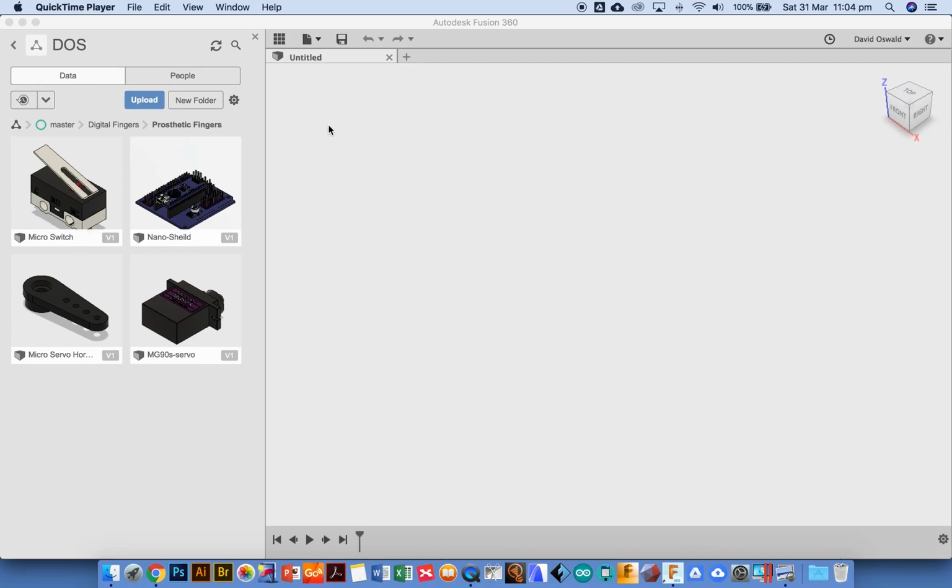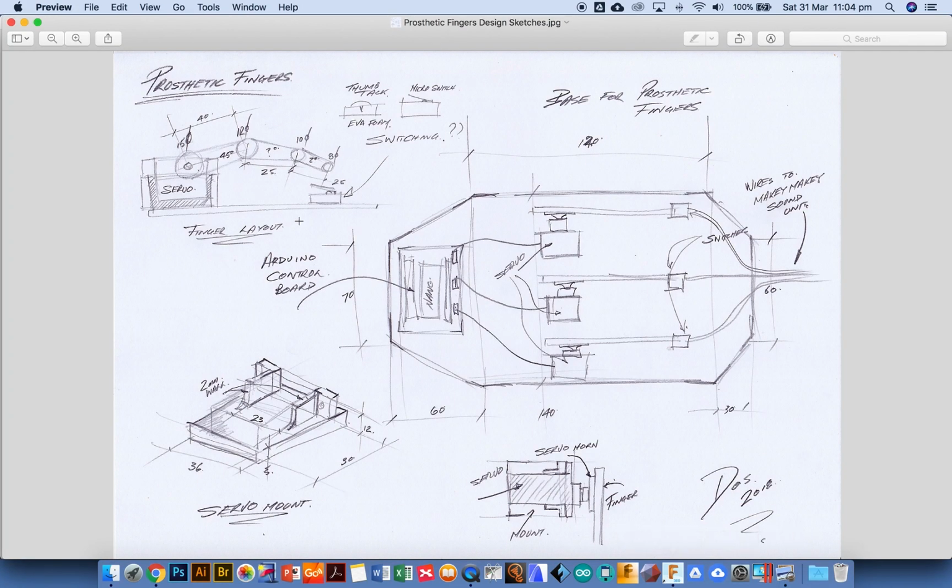The very first part that we're going to look at, based on your sketches, so in here I've got a mount, the finger and a base. They're basically the parts we're going to make up. Maybe a small mount for those switches. But let's just have a look at the finger to start with.